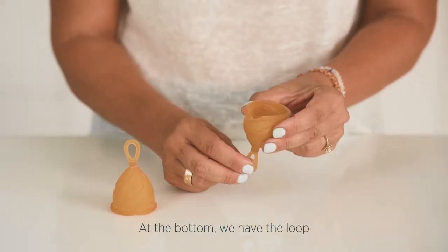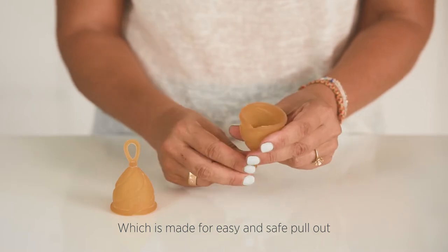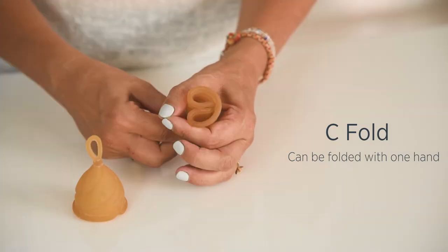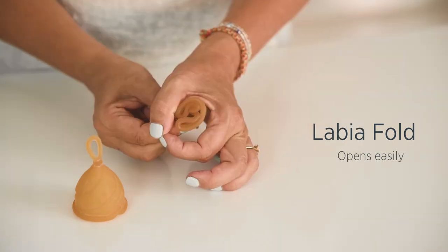At the bottom we have the Loop, which is made for easy and safe pullout. The C-Fold can be folded with one hand. The Labia fold opens easily.